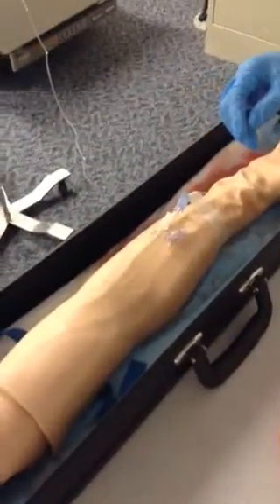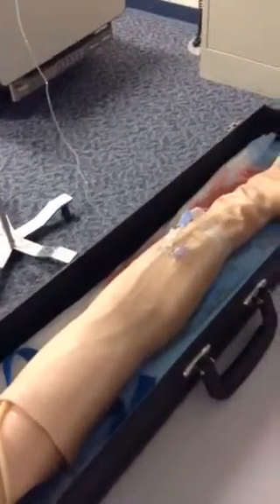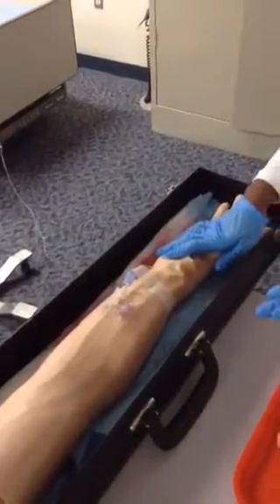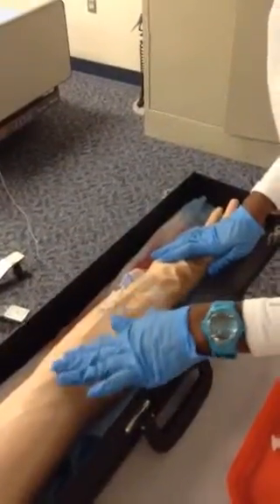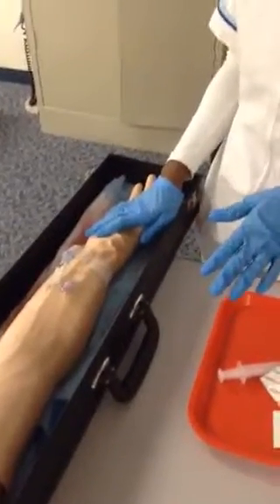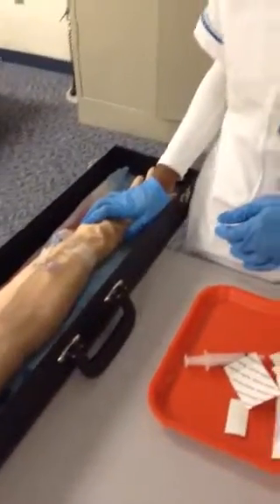I will document time and date, and the IV site, which is the right forearm. I will document the number of attempts, which was one and was successful. I would also let Mr. John Doe know not to tug on the IV, and I'm going to look for any infiltration, redness, or inflammation. I'll let the client know that if he sees anything like that, to let a nurse know. This documents placement. I taught the patient — it was a 20-gauge needle. And that is it.